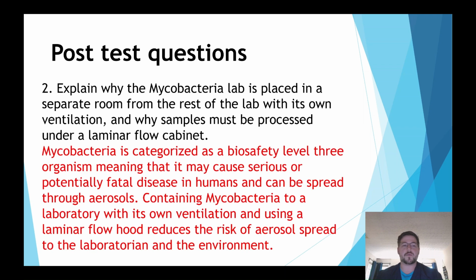And the answer to that one is Mycobacteria is categorized as a biosafety level 3 organism, meaning that it may cause serious or potentially fatal disease in humans and can be spread through aerosols. Containing mycobacteria to a laboratory with its own ventilation and using a laminar flow hood reduces the risk of aerosol spread to the laboratorian and the environment.